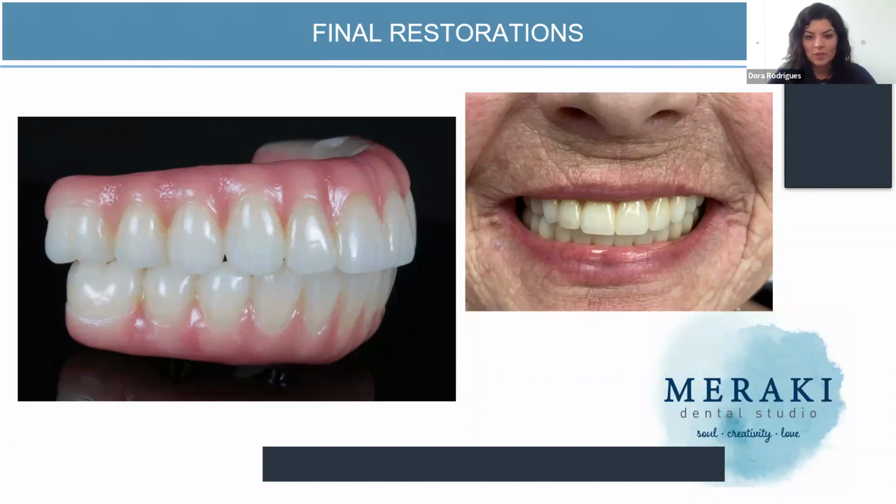And again, it's reproducible. If something breaks, I can just reprint another prototype that the patient can wear while we're waiting to finish the case.